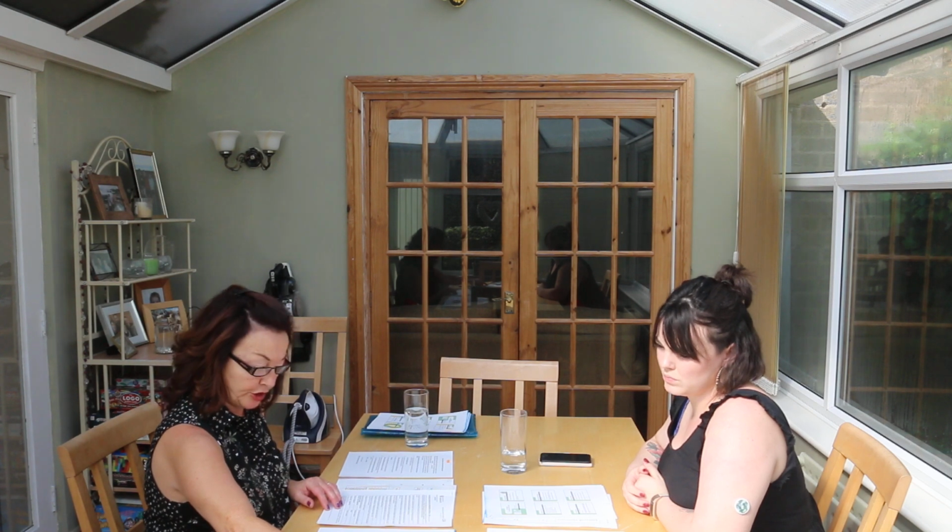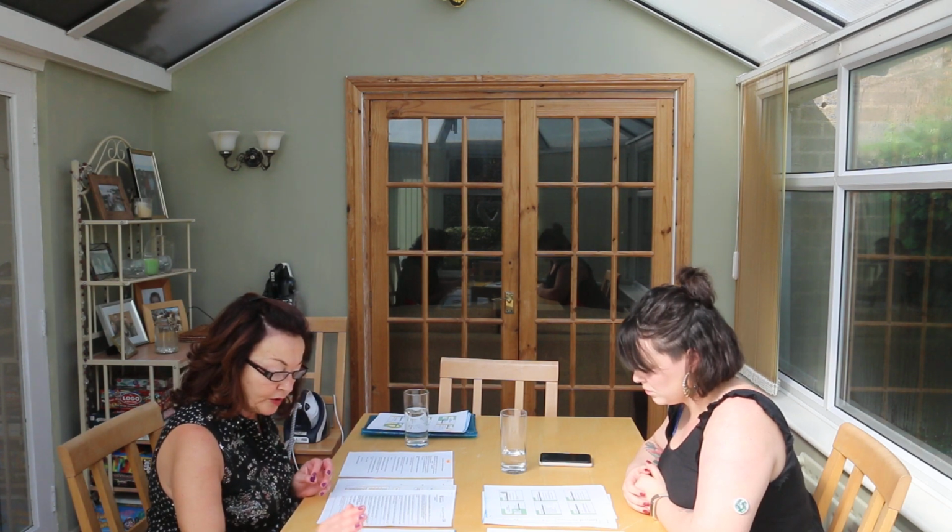Oxygen is white. This is blue and white. It's a mixture. And I always mention to nursing staff, because obviously you have community midwives going out doing home deliveries, that as we are getting colder winters, if the cylinder goes below -6 degrees in the boot of a car, what happens is the nitrous oxide and the oxygen splits, so therefore a patient could be purely self-administering nitrous oxide. So that would be very, very dangerous.